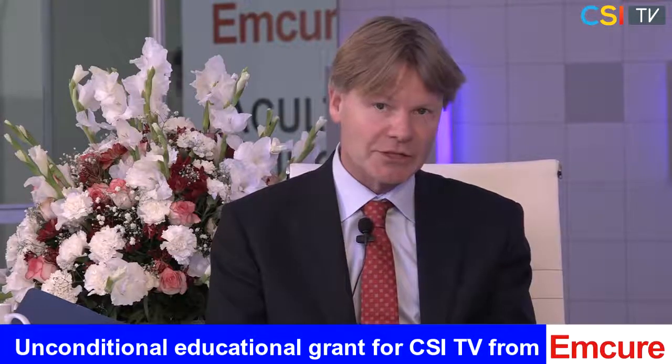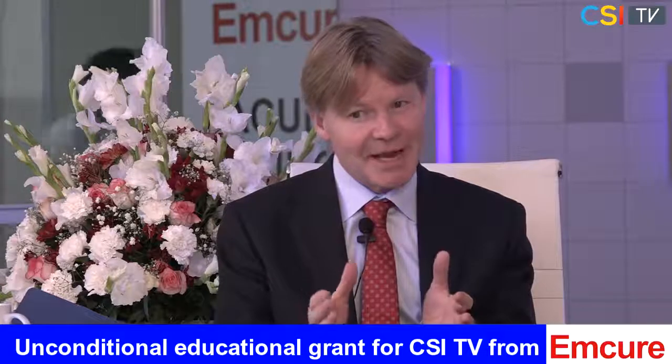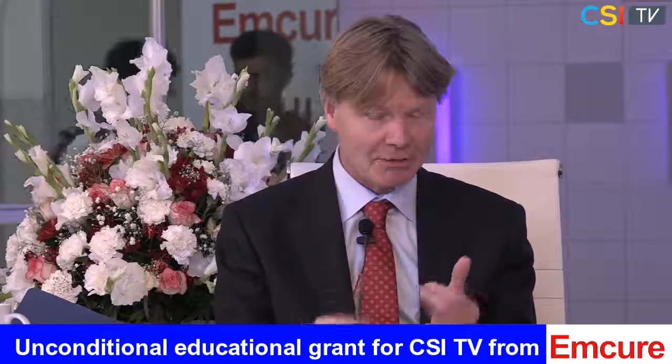So the ventricle dilates, dilates, dilates. At some moment the ventricle cannot handle it anymore and it becomes too stretched, so fibrosis is going to be formed. So these two are excellent examples of where T1 mapping can help us see if this ventricle is still okay or too much fibrosis is coming. Late gadolinium is visual, what you see, the white, dense, macroscopic scar.